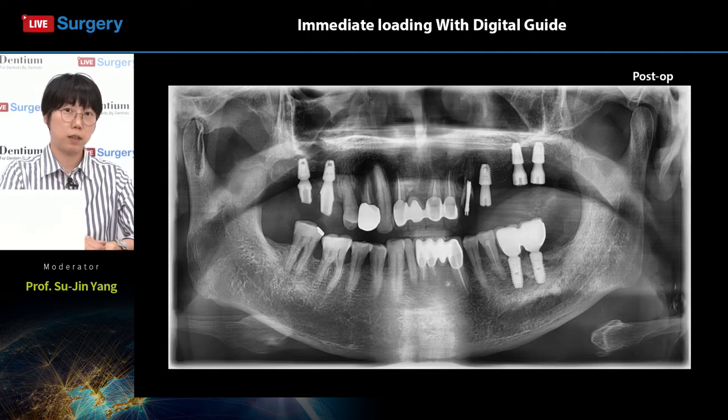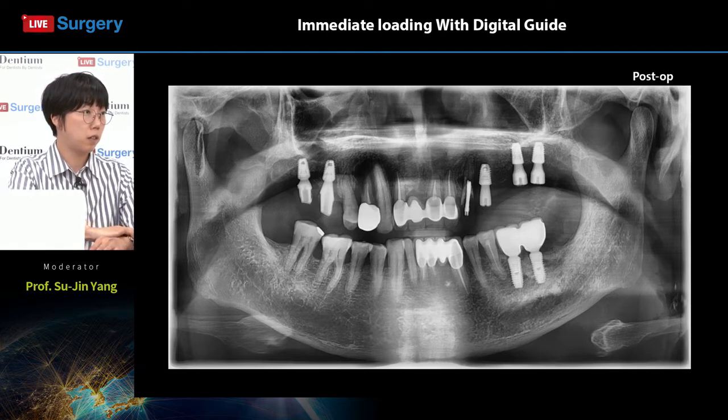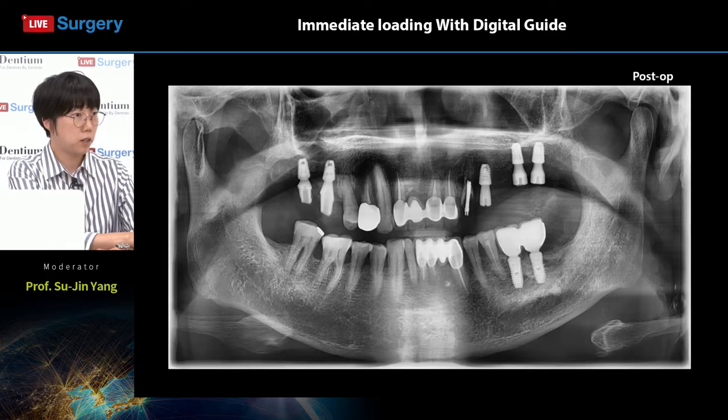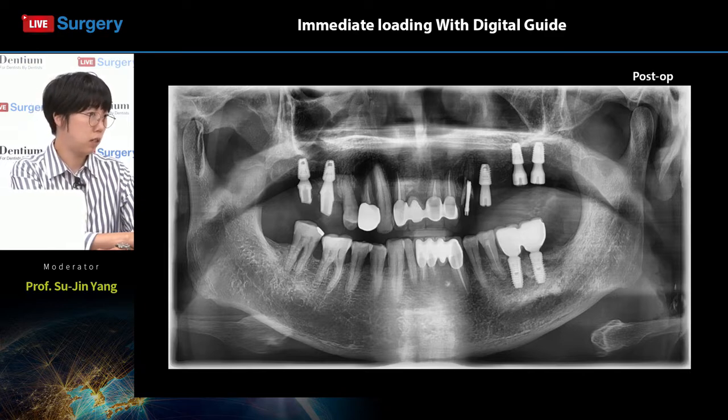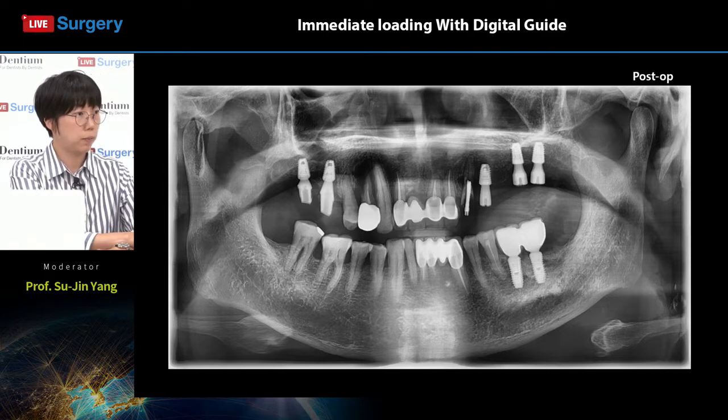We are back with the post-operative radiograph. As you can see, there are implants placed in the upper right and upper left areas with a small amount of GBR and sinus floor elevation on tooth number 17 area. The implants are positioned a little deeply into the bony housing, but are nonetheless secured well into the patient's bone.